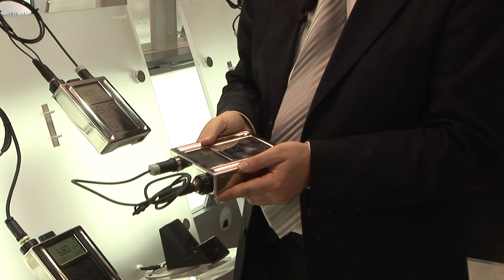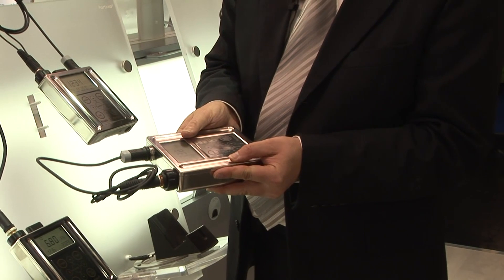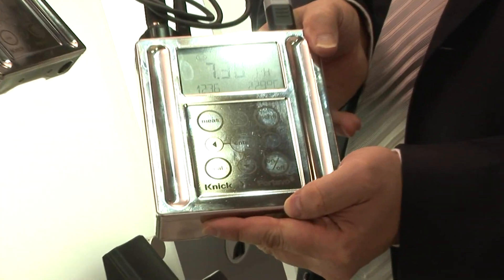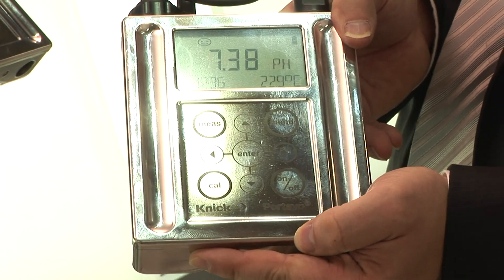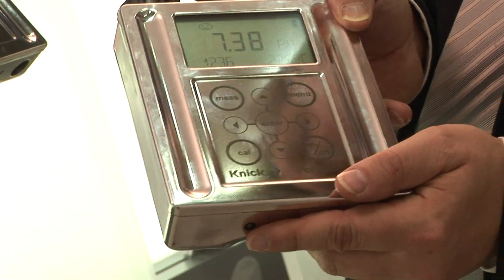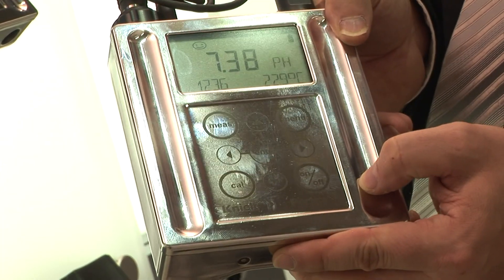It can be easily cleaned. It's stainless steel with an electro-polished surface. Something which is really new on the market is the keypad. It's a big problem on those systems — the keypad will have crevices where bacteria or dirt can accumulate. Here we have integrated the keypad directly into the stainless steel material.